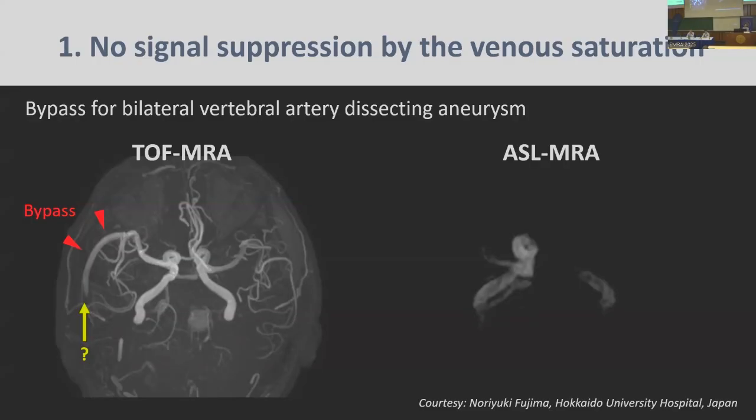Without doubt, time-of-flight MRA is the workhorse of non-contrast MRA, completely non-invasive and providing high spatial resolution within a very reasonable scan time. So its contribution to everyday clinical diagnosis is significant. However, even such a workhorse is not always successful.